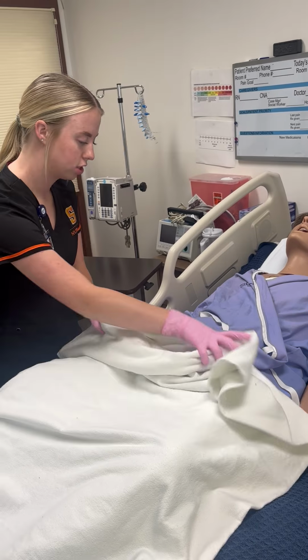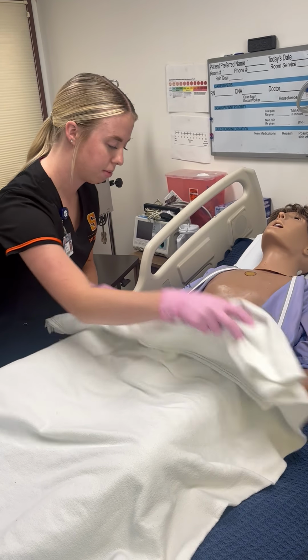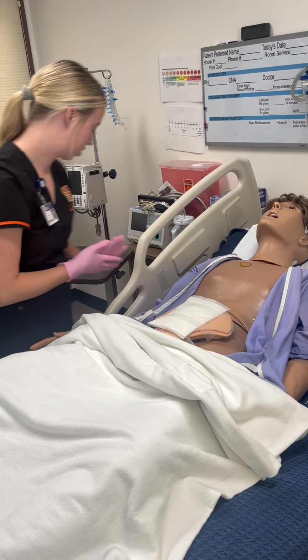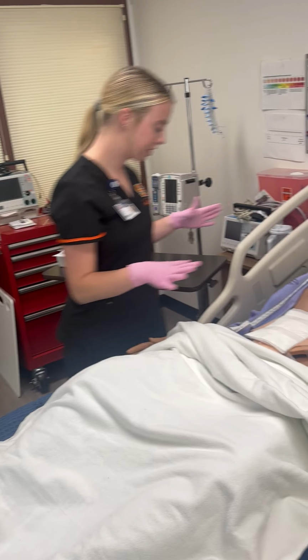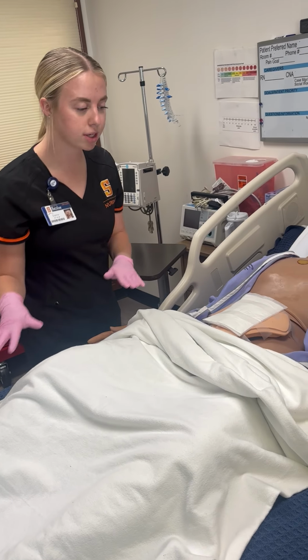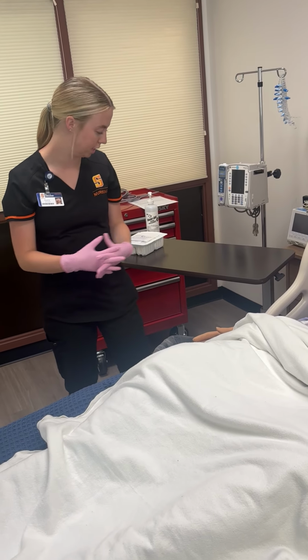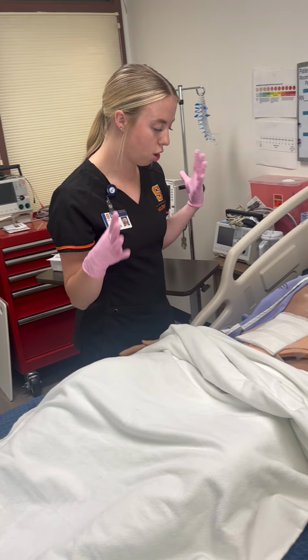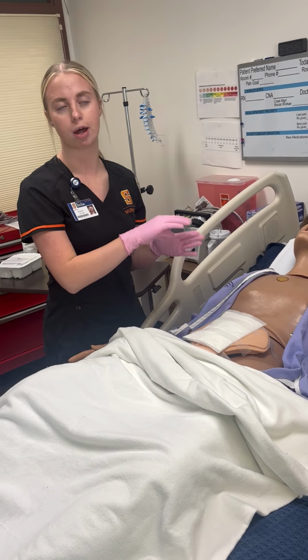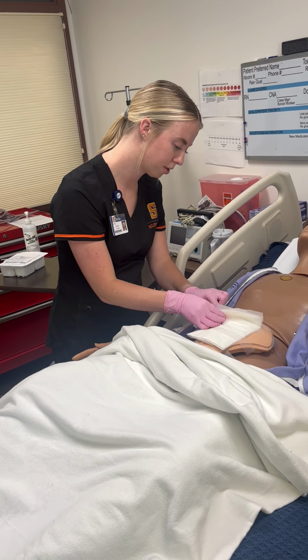I am going to take this down and just reveal that wound. Nothing else. Keep my patient's privacy. All right, let's make sure I have everything. I'm gonna assess for any tubes, drains, or anything that'd be in the way, and I'm not seeing any that I should need to take care of or move out of the way so that my patient is safe and taken care of. So next I'm going to remove the dressing that is on, and I'm gonna do the pull method and follow with the hairline. So I'm just gonna pull this up a little bit.